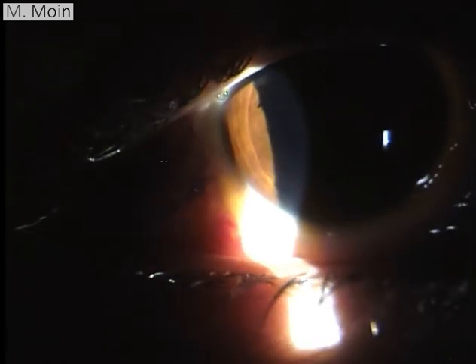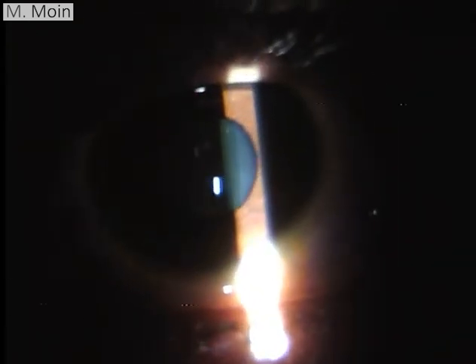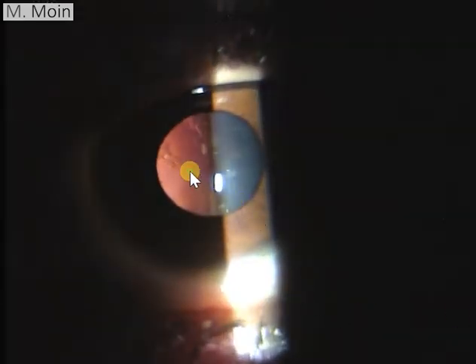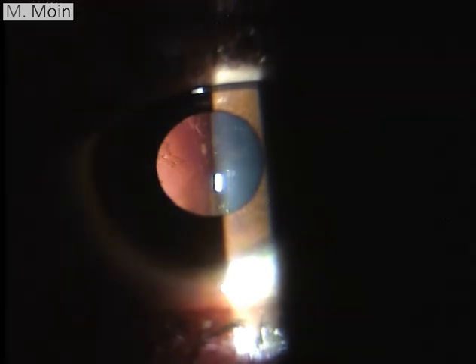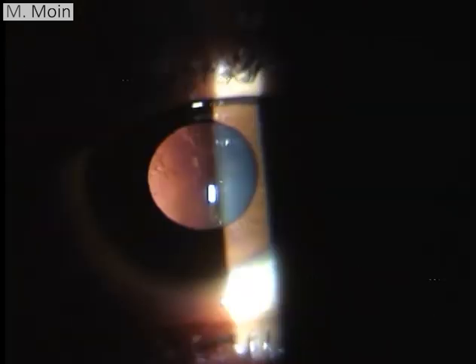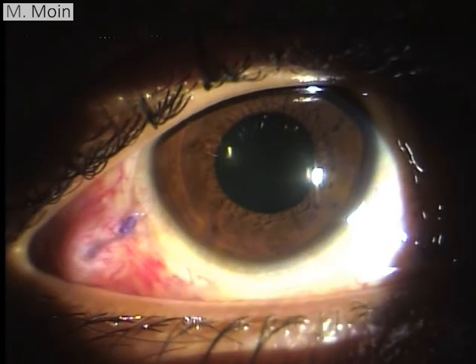Looking from outside, you can see the patient is phakic, and oil will produce some bit of cataract. Here you can see some posterior subcapsular cataract opacities, which I'll show you. If you see oil, sometimes you'll see those star-shaped opacities, but these are opacities due to the silicone oil. The other thing which we need to focus on is externally, on the conjunctiva where the sutures are placed. So this is looking at the red reflex of the lens and identifying that. Then this was the right eye of the patient.